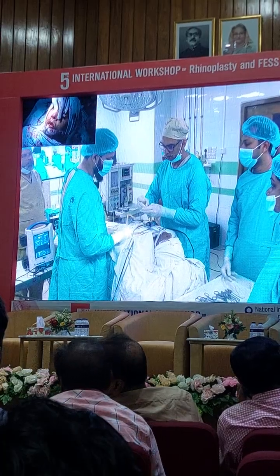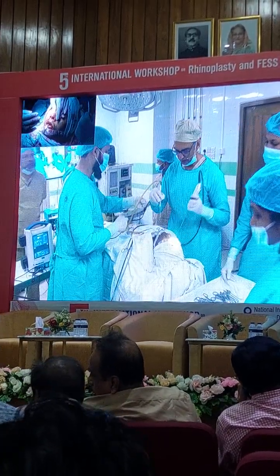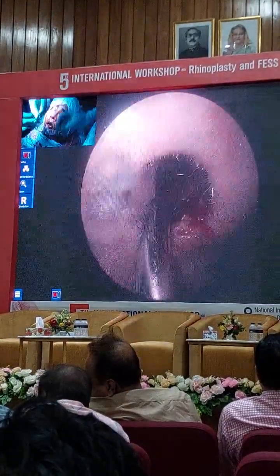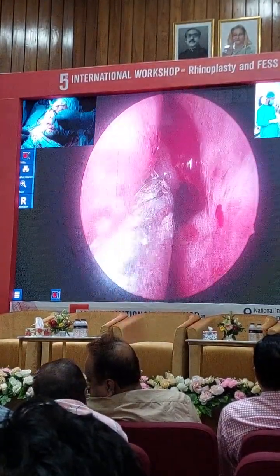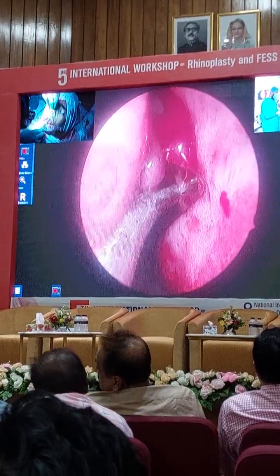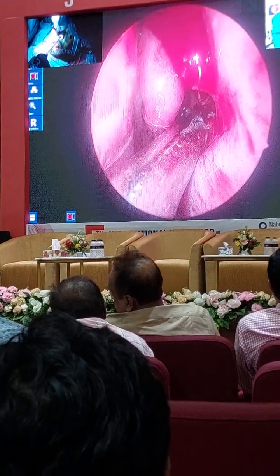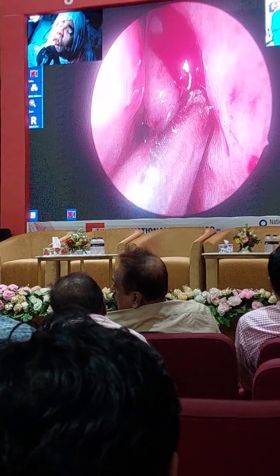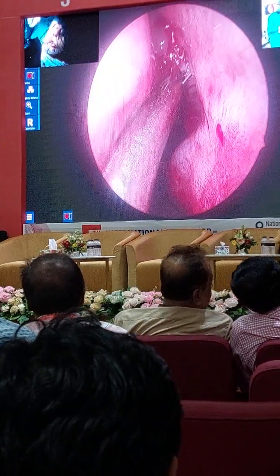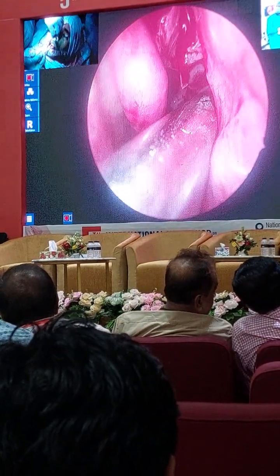Okay, whatever we are using, these are the same steps. Now, I would much prefer a 45 than a 0 because it allows me to move my turbinate out of the way and work inside and be able to do the uncinectomy. It also allows me to take out the uncinate in its anterior aspect without damaging the mucosa in front, which can happen with a 0-degree debrider.